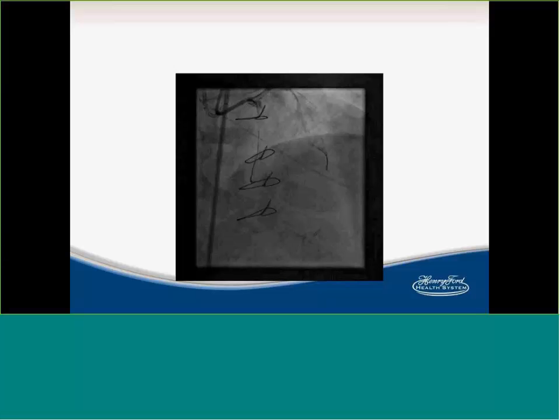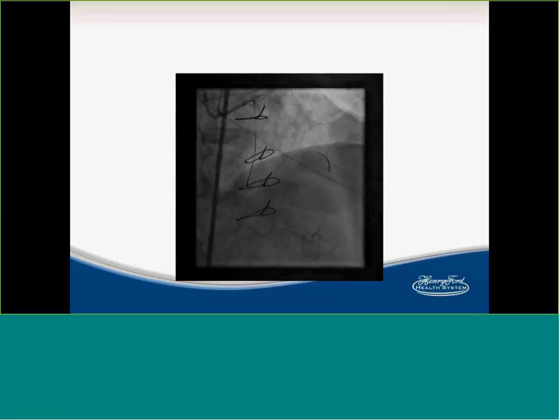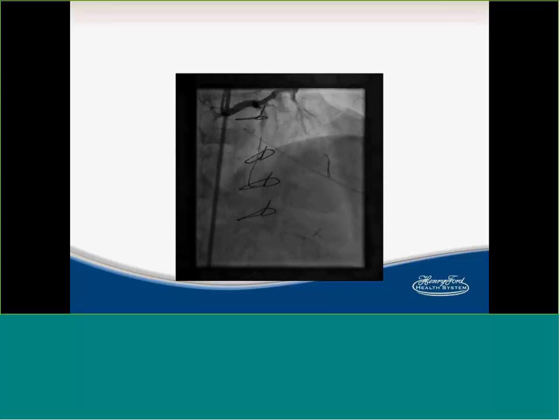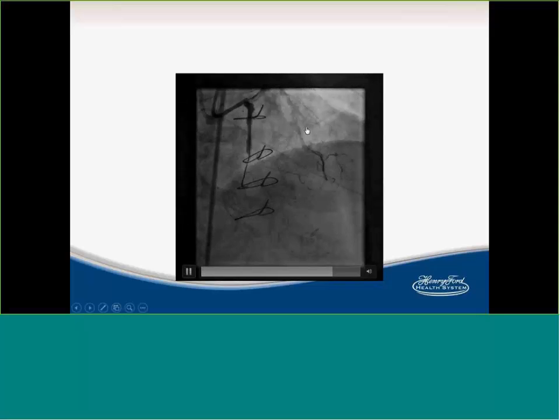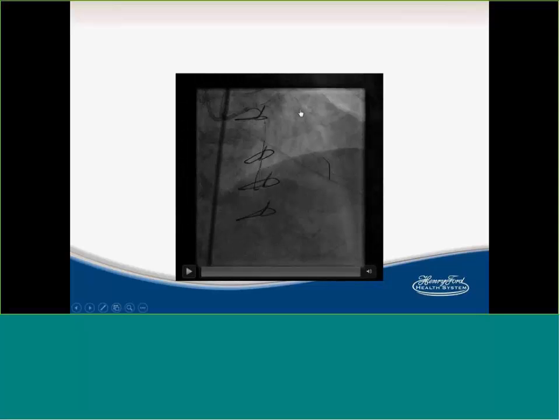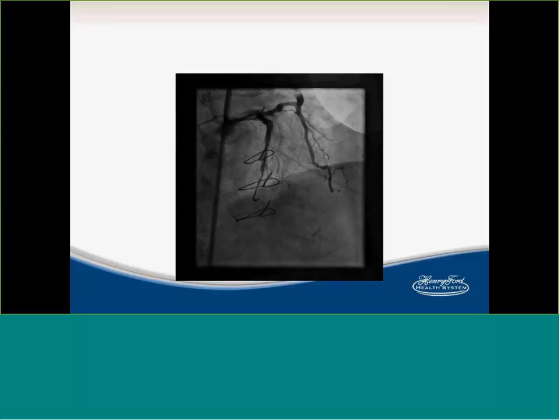Stefan, close them all. Aaron keeps them open. You keep them open. I'm actually selective. And I'm selective because when I see a lot of competitive flow, I made sure to jail the insertion of this graft by a stent, but there is a lot of competitive flow. And this graft has a stent fracture, and every time I tried to deliver the device through, I could feel it getting stuck at the stent fracture in there.